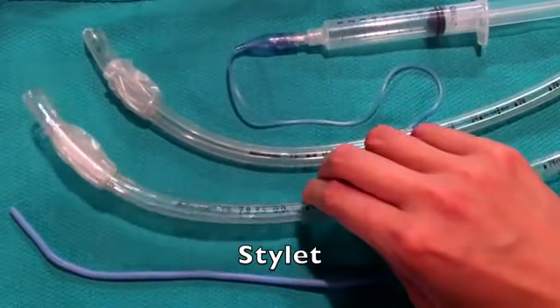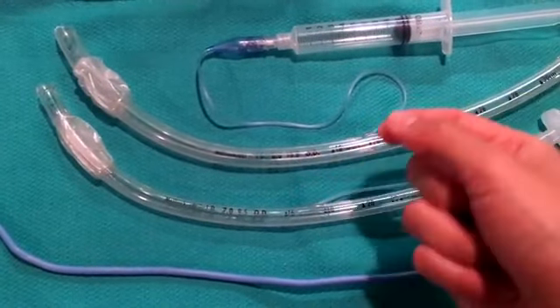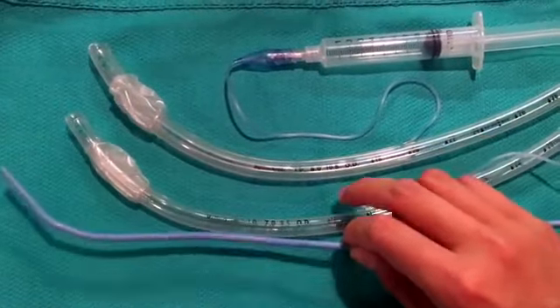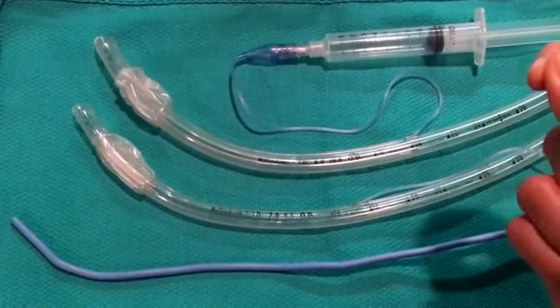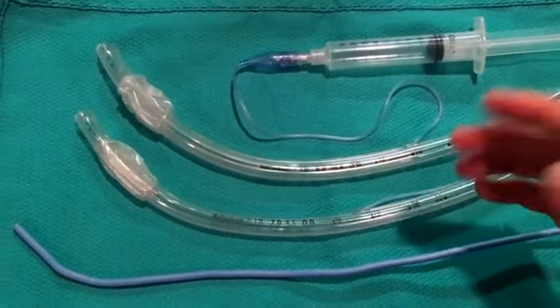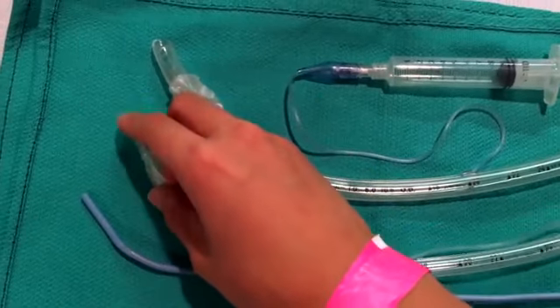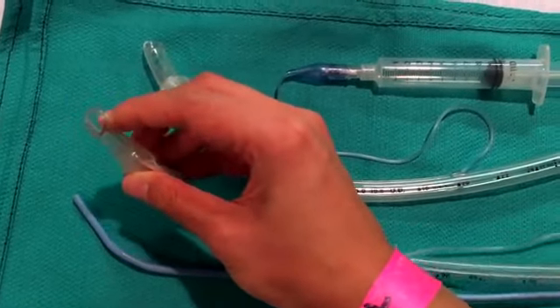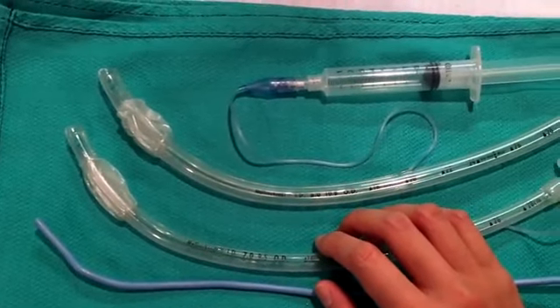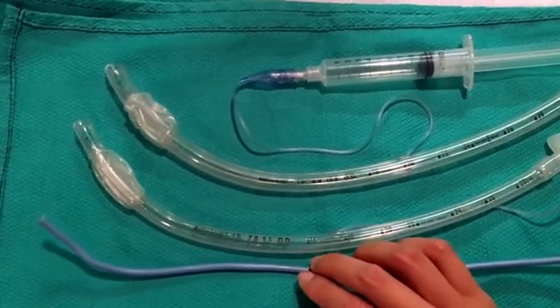There you go. And then also there's something called a stylet. This is very flexible, which is good, but sometimes we need it a little firmer for when we insert it. If you place this inside the ET tube, it allows for an easier way to insert the ET tube without it being too flexible. It's important that when you insert this, you don't let it poke out past the end of the ET tube or out of the Murphy's eye, because then you can puncture the trachea, and that can be really bad for the patient, an unnecessary injury. I'll show you in a bit how best to position it.